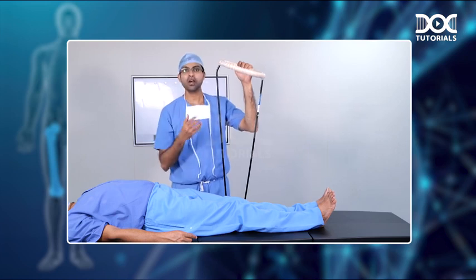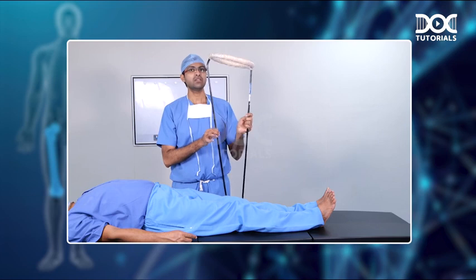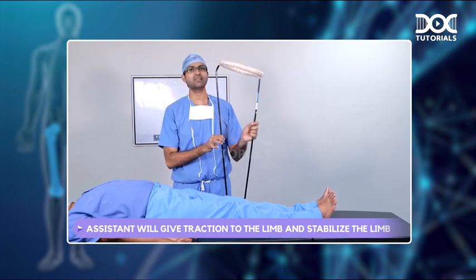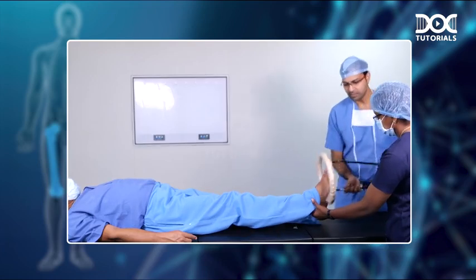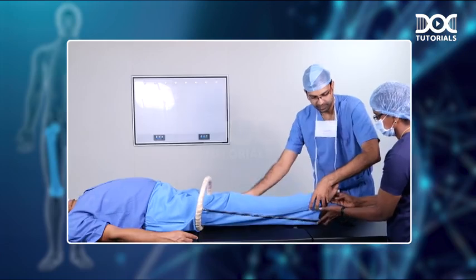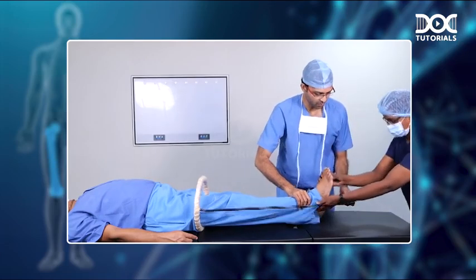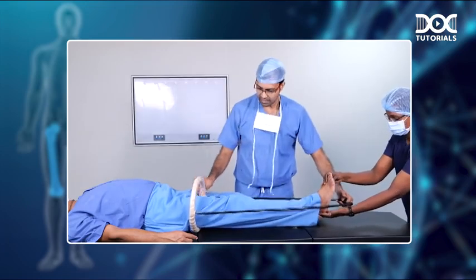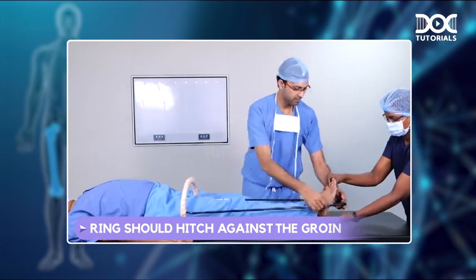Now I will show you how to put the Thomas splint. Again, for the application of Thomas splint, you need an assistant who will give traction to the limb and stabilize the limb. So I will gently put the Thomas splint inside like this. My assistant will give traction and hold like this, and make sure that the ring should hitch against the groin of the patient like this.